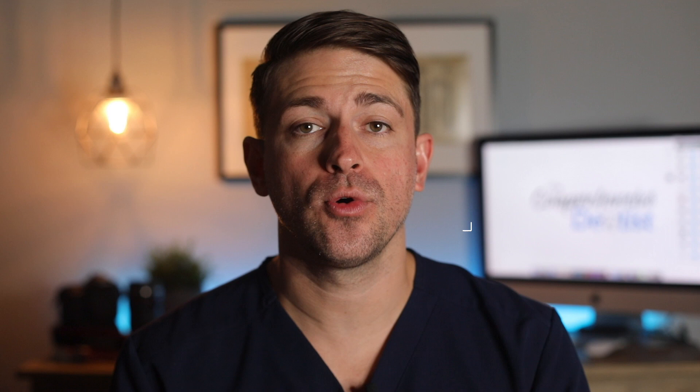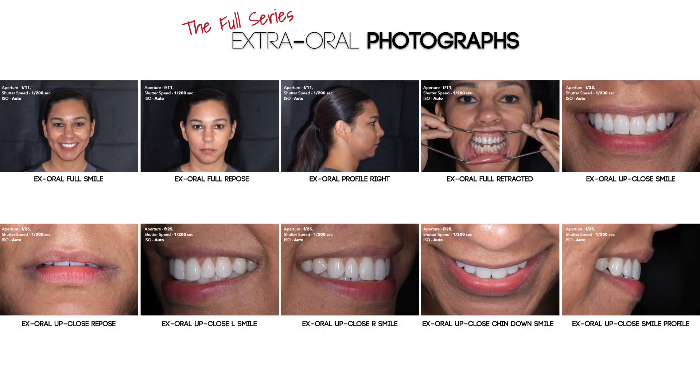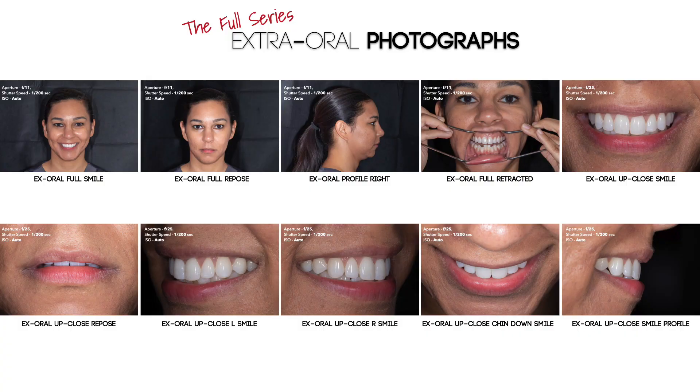Hello, and welcome to another video from The Comprehensive Dentist. My name is Dr. B, and in this video, we will learn how to take extra oral photographs of our patients. I will go into some depth on each shot and show you how I position the patient and myself for these images. We will go through all the extra oral photos that I take as part of my full series of patient photographs. I hope you can watch this video and get a good idea of executing these photographs yourself.